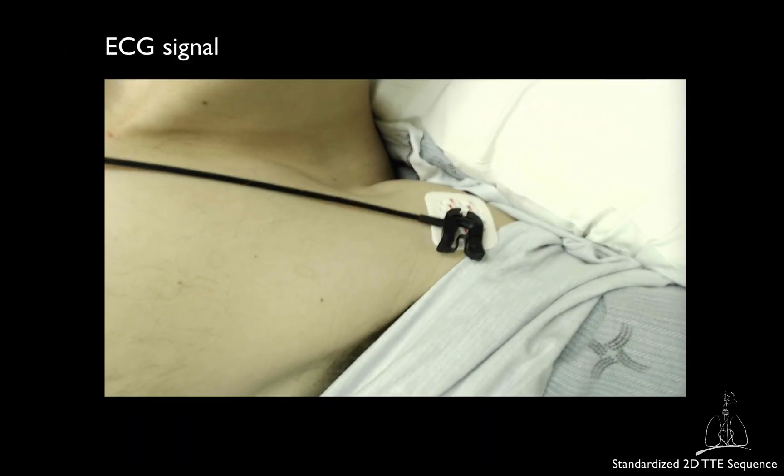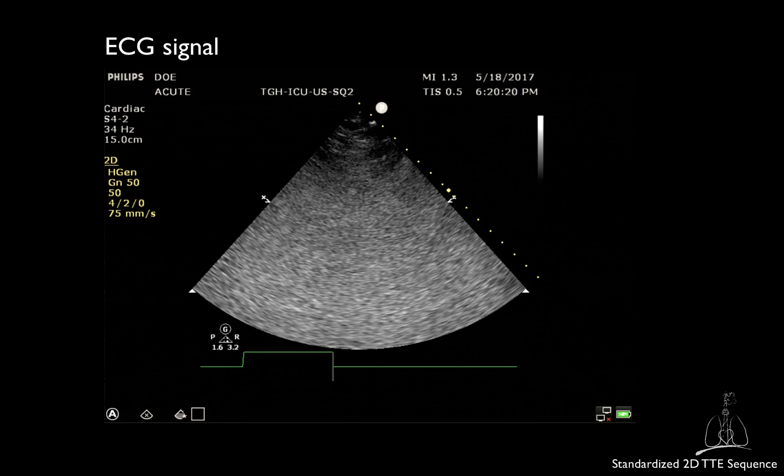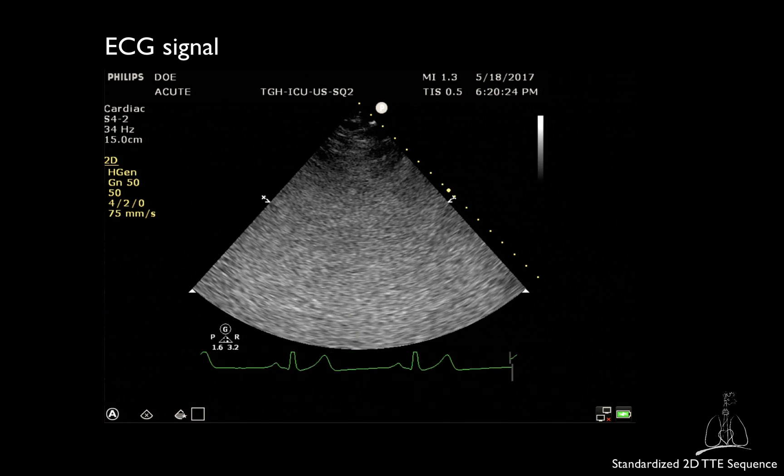Another crucial step is the placement and connection of the ECG electrodes. Make sure you have a good ECG signal on your monitor. Once the patient is in the correct position and you have recorded all the necessary patient data, you can start your examination. Our sequence starts from the parasternal views, though you may choose to start with the subcostal views, as long as you follow a structured sequence and do not skip any view or step.